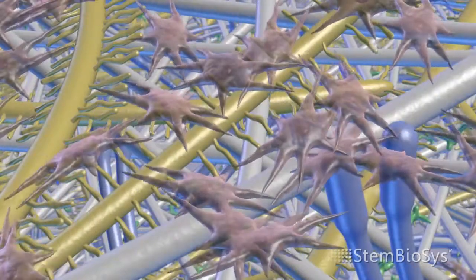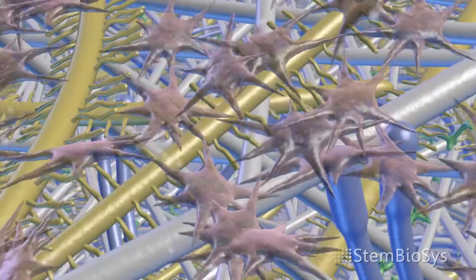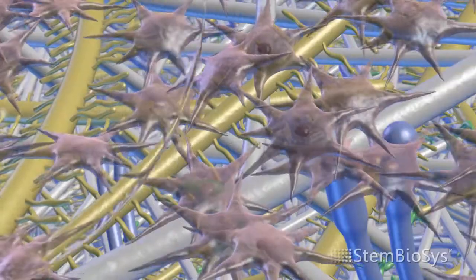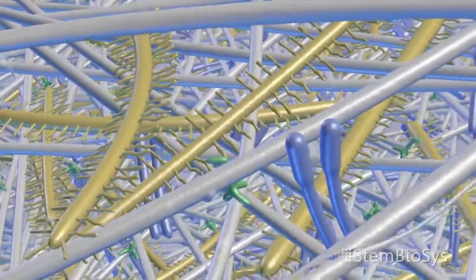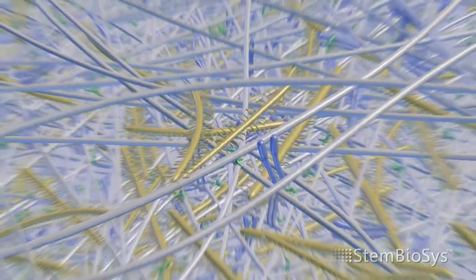Following production of their extracellular matrix, the remaining bone marrow stromal cells are removed, very gently, so as not to change the architecture or the biochemistry produced by the cells.